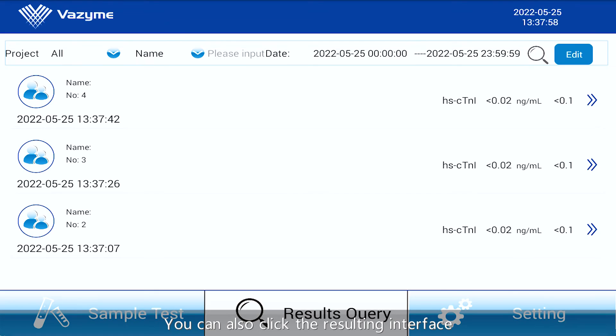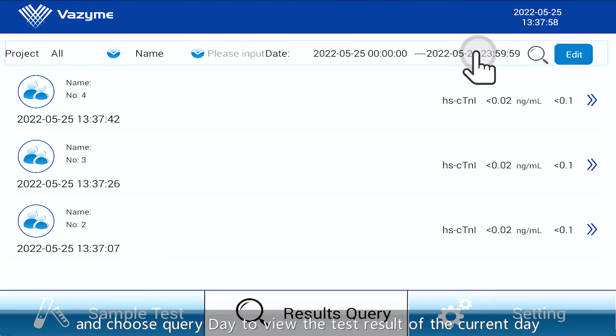The test result pop-up window will appear automatically to display the test result of the sample. You can also click the resulting interface and choose Query Day to view the test results of the current day.